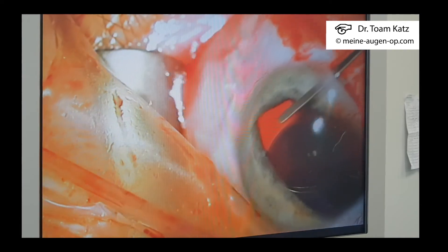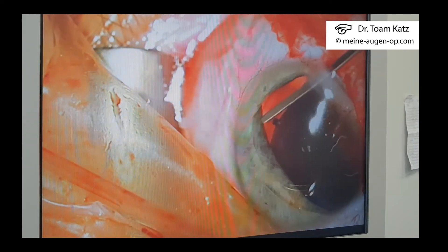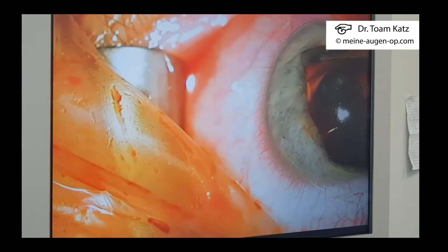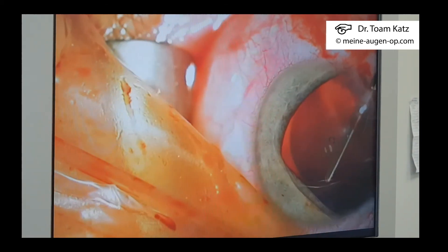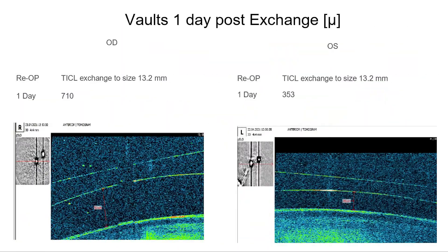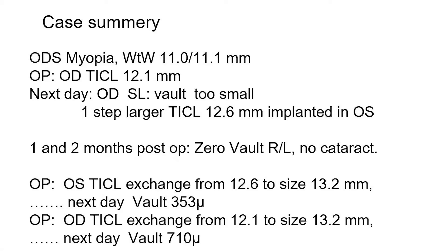After the end of the surgery and removing the viscoelastic, we would expect a better vault. We did succeed in both eyes to get a much better vault. The left eye that was operated first had a vault of 350. The right eye, which was operated second, reached a post-operative day one vault of 710. We were happy with solving the problem.